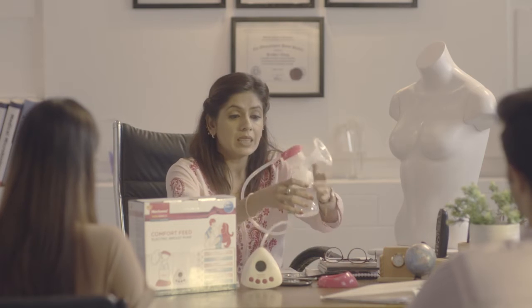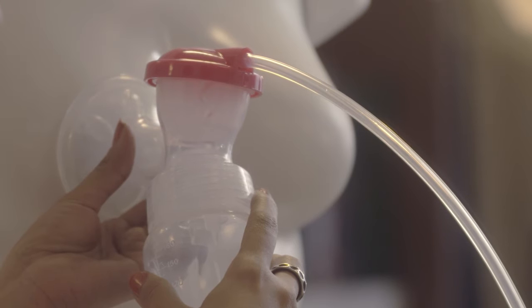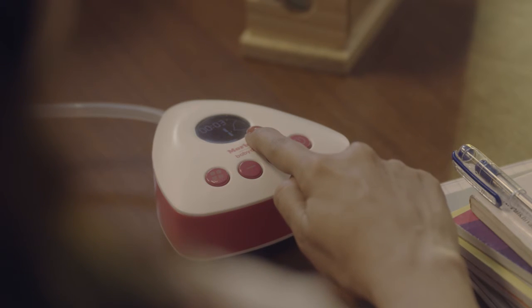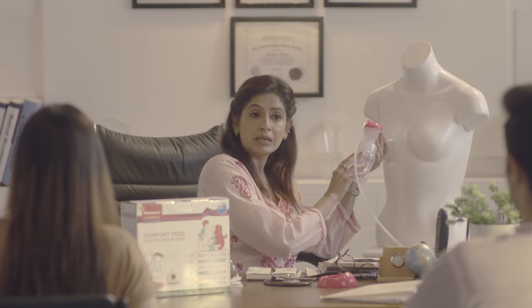First, wash your hands and then press the funnel firmly — make sure there is no air to escape, otherwise there will be no suction. Now switch on the pump. The black background screen will indicate the massage sign on the right side. The breast pump automatically starts up and warms up your breast for two minutes. Warming up stimulates the breast to let out milk.